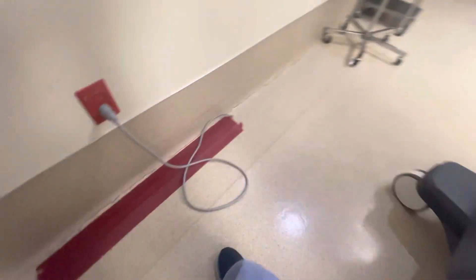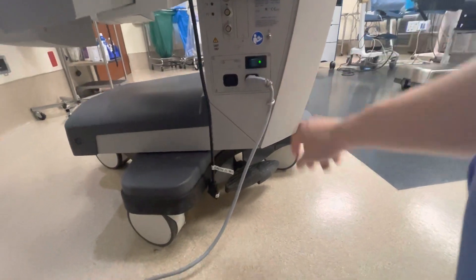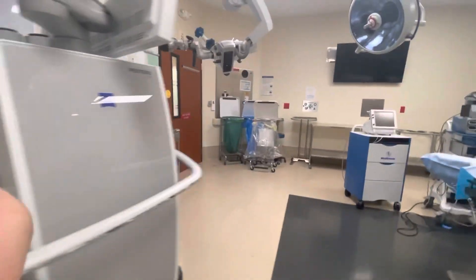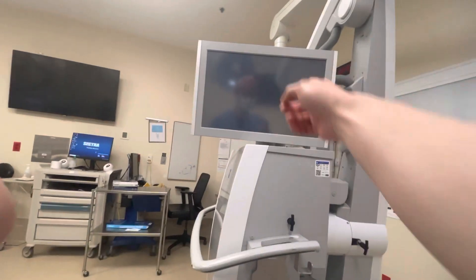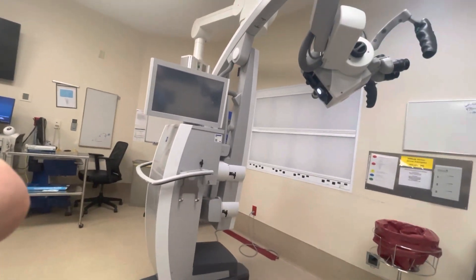Go ahead and make sure it's plugged in — a lot of times the cleanup crew will unplug it. A lot of people don't know about the power button on the back. Flip that on, and when you do that it takes about three minutes to boot up. Don't go looking at the monitor right here because there's nothing to turn it on from there.